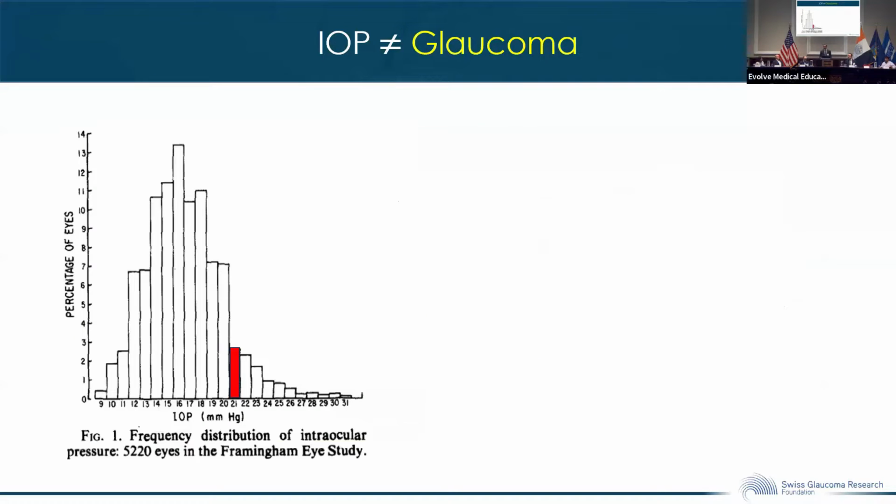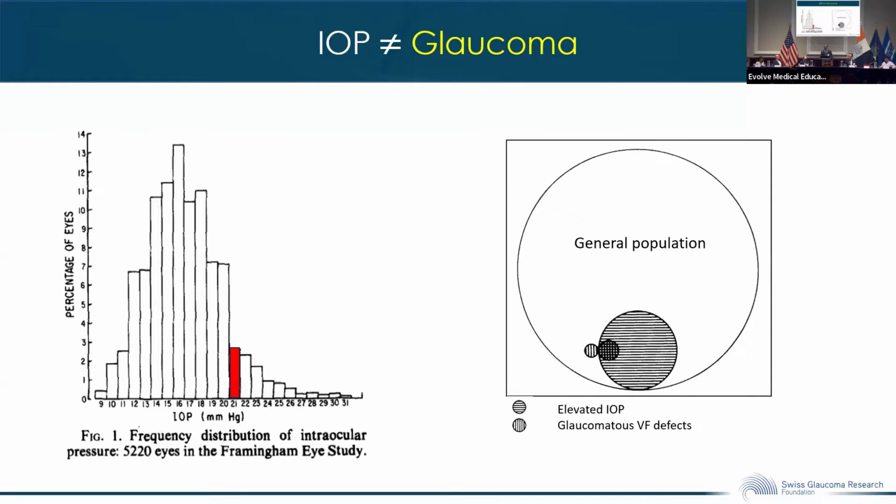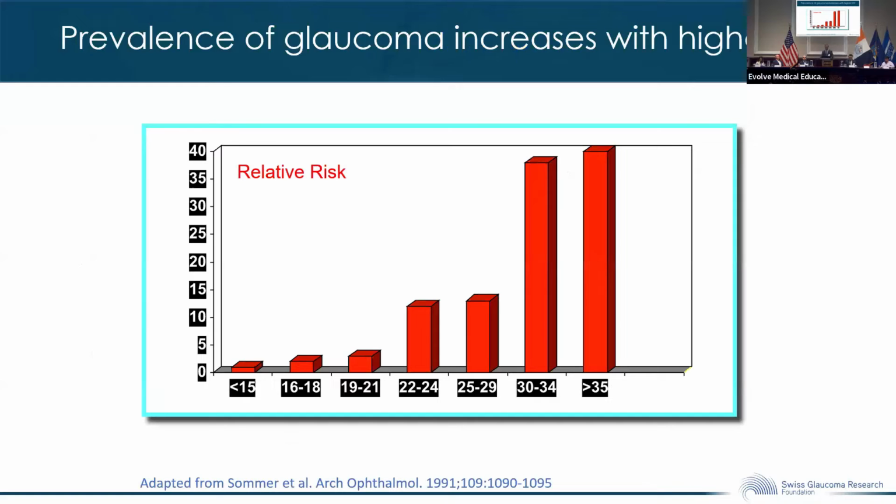So this was a one-size-fits-all approach to glaucoma, which of course is not valid, and thankfully so today. We have moved away from assuming IOP defines glaucoma. We know now that half of the patients who have IOPs above 21 may not have glaucoma in their lifetimes, and probably half of our patients who have confirmed glaucomatous visual field and optic nerve changes have IOPs below 21, at least when we measure them in the clinic every now and then with GAT.